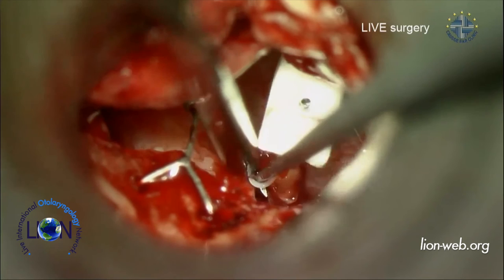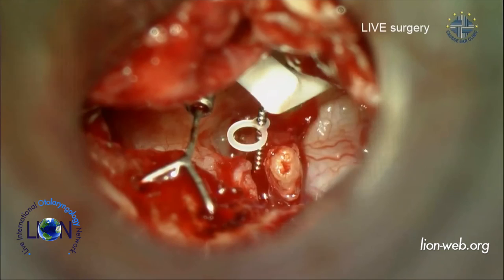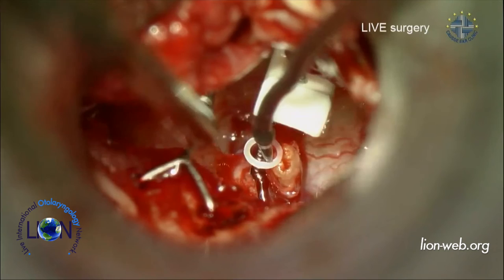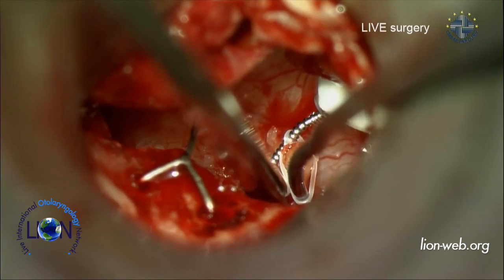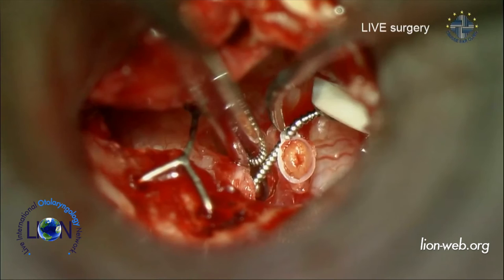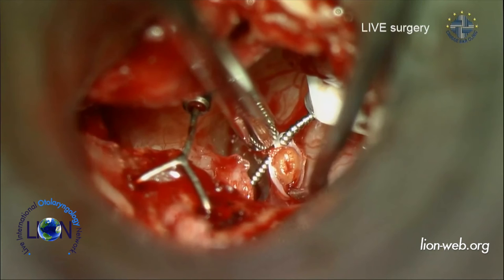Of course, it's not easy here because I take care of the stapes, which is really hypermobile. Let's see, maybe with a needle. It's not good. So we'll try with the other one. I do it very gently in this case because of the stapes again. I think I need to place it in this here. And then I need to push this down. Okay, it's not enough. I need to place it underneath some kind of fibrous tissue here or tendon.